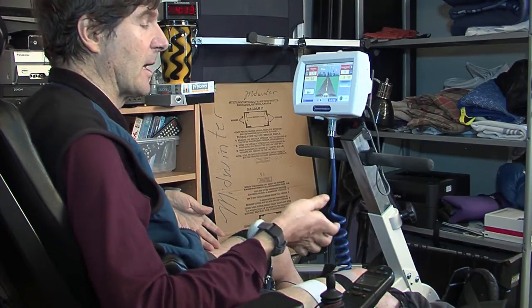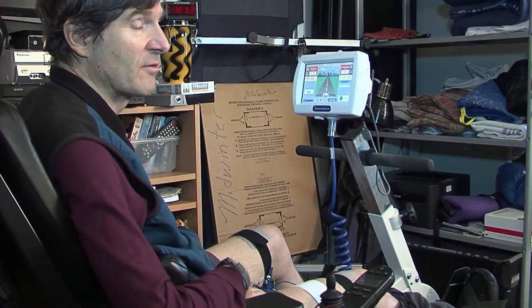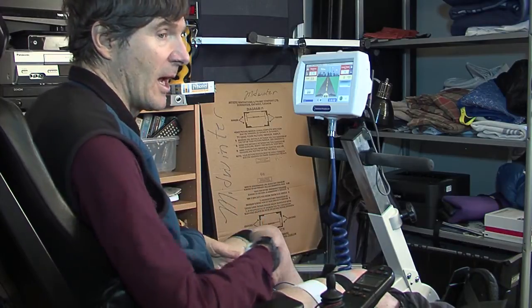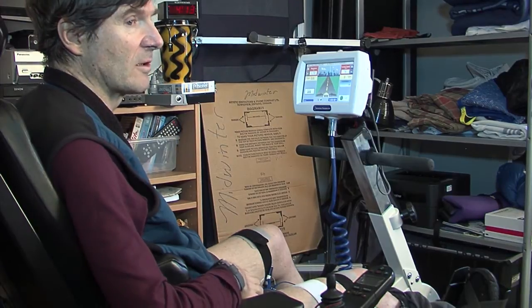The bike can either do all the work for you, or if you have some volitional control over your muscles, you can overpower that stimulation and use your own muscles to move the cycle.